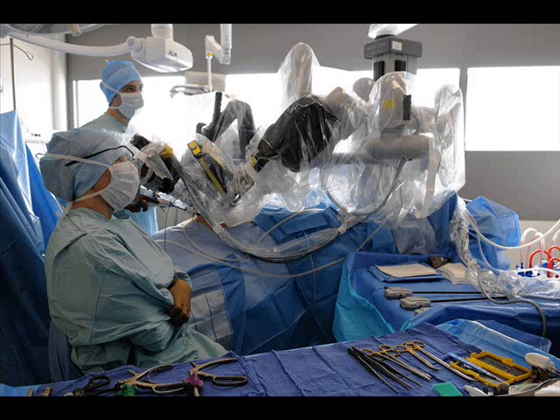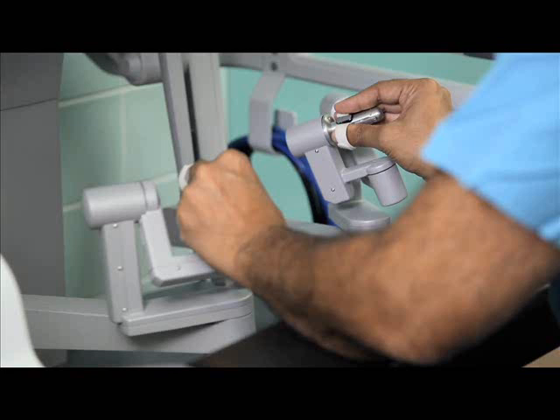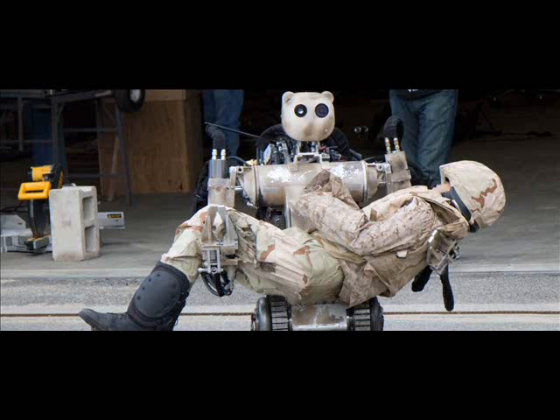Neurosurgery. Several systems for stereotactic intervention are currently on the market. The NeuroMate was the first neurosurgical robot, commercially available in 1997. Originally developed in Grenoble by Louis Benabid's team, it is now owned by Renishaw. With installations in the United States, Europe, and Japan, the system has been used in 8,000 stereotactic brain surgeries by 2009.